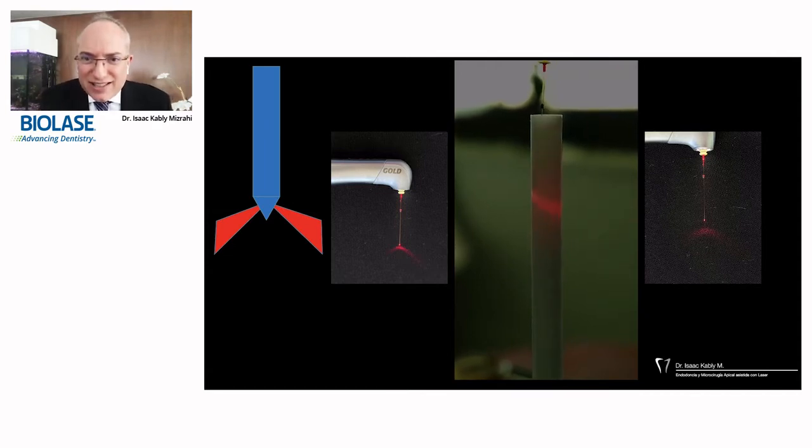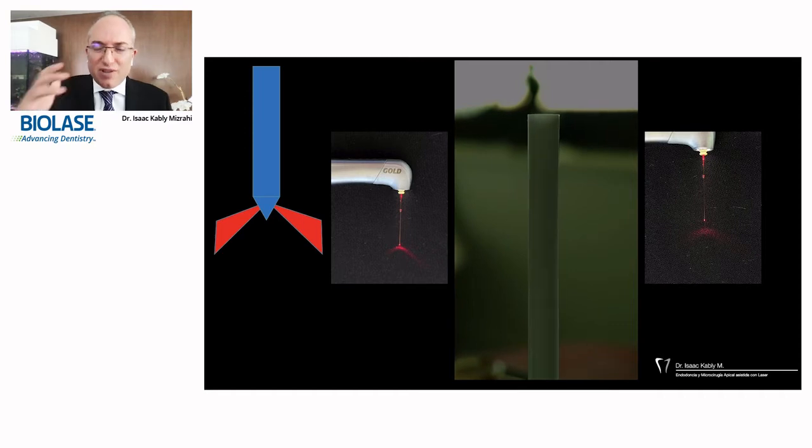But see what's next. Now I'm touching the plastic tube all around with circle movements, and you can see how energy is delivered there only with the aiming beam taking part of this. Of course, this is not the laser energy of the Er,Cr:YSGG, it's just the aiming beam. But it gives us the perfect example of how it works inside this simulation.